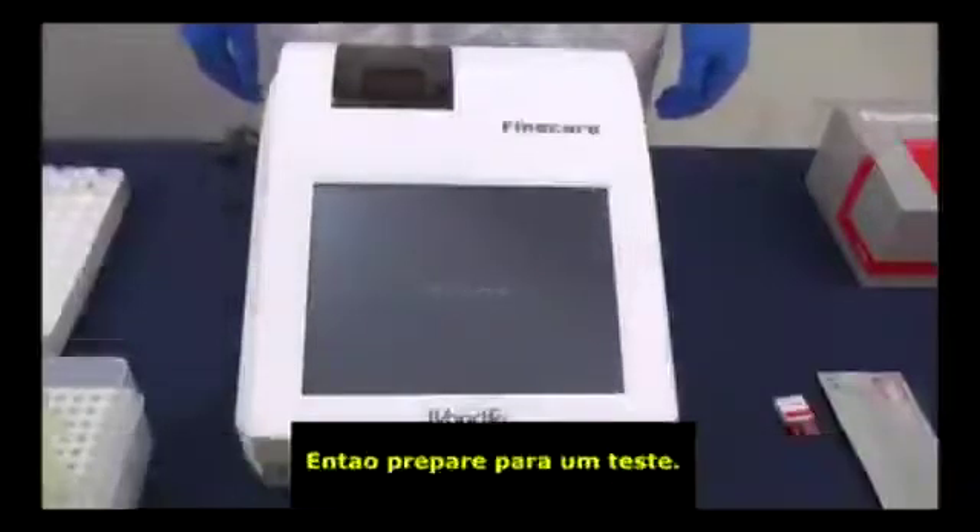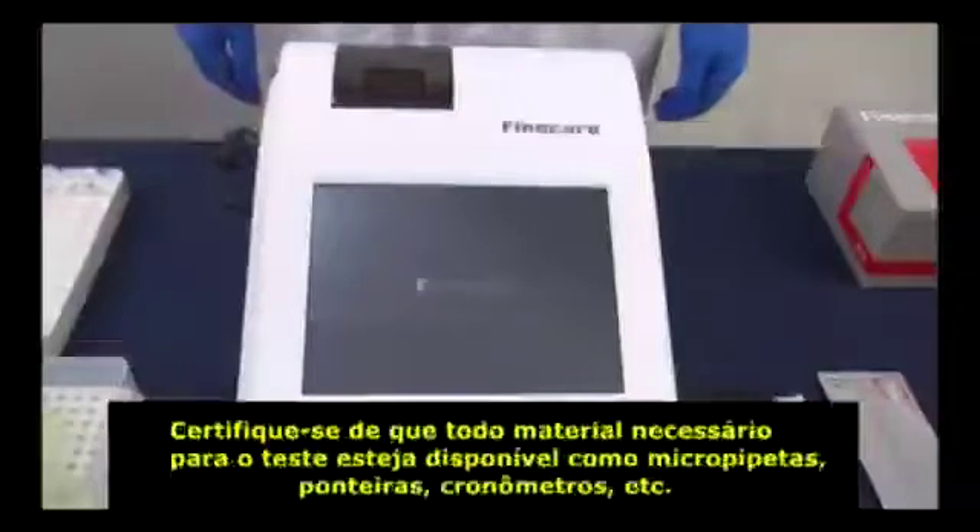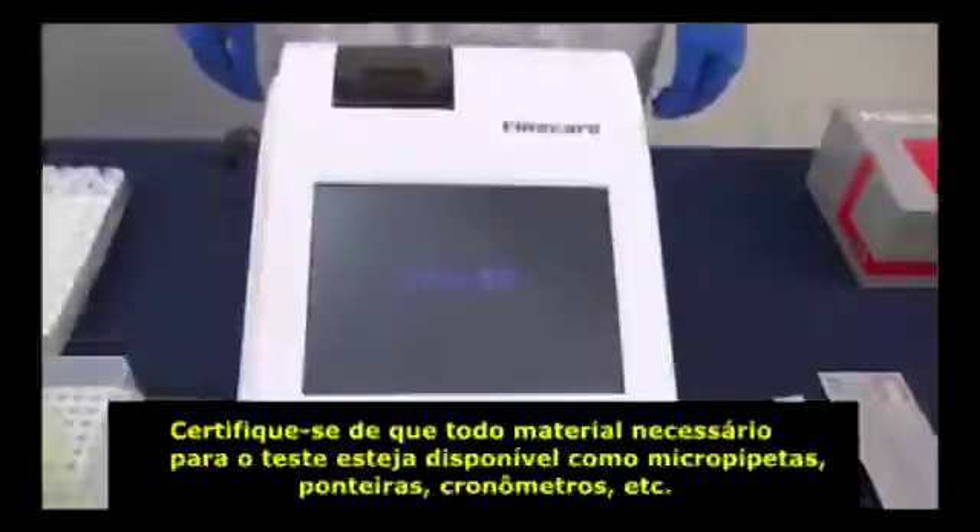Then, prepare for a test. Make sure you have everything within reach before testing, such as micropipettes and their tips, timer, etc.